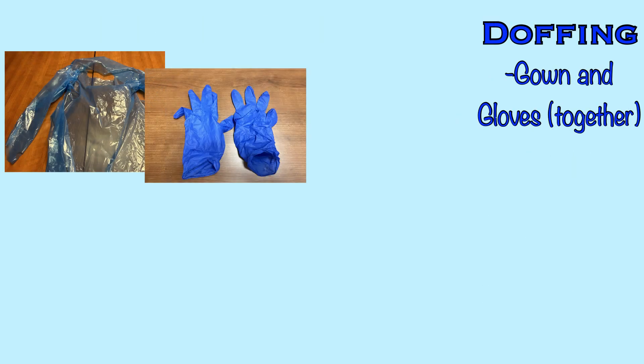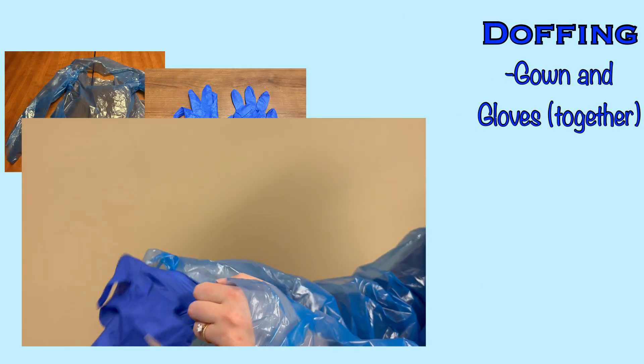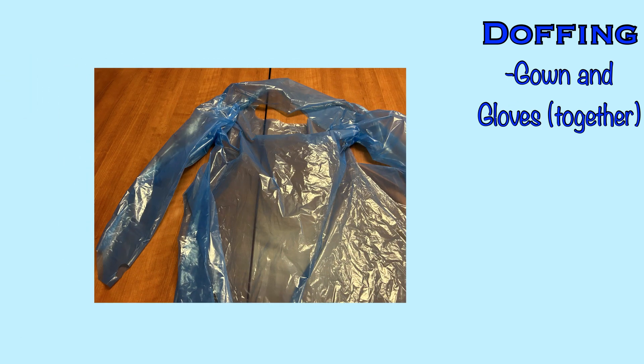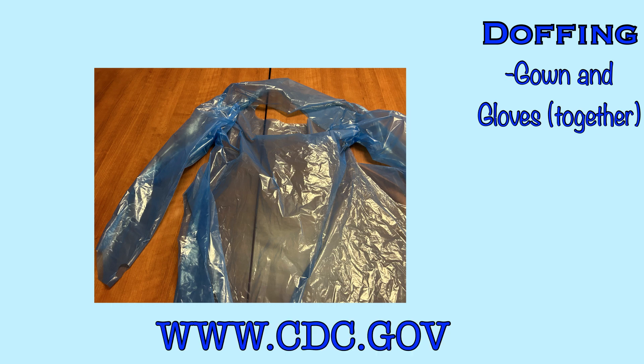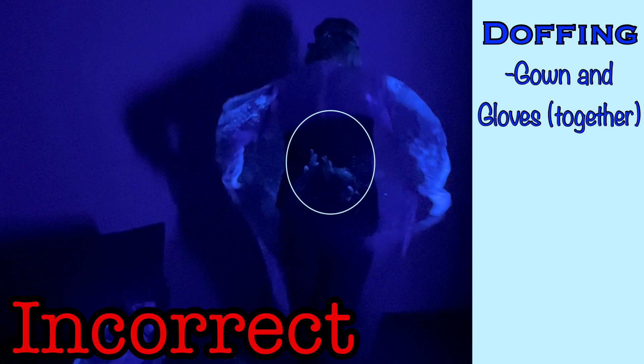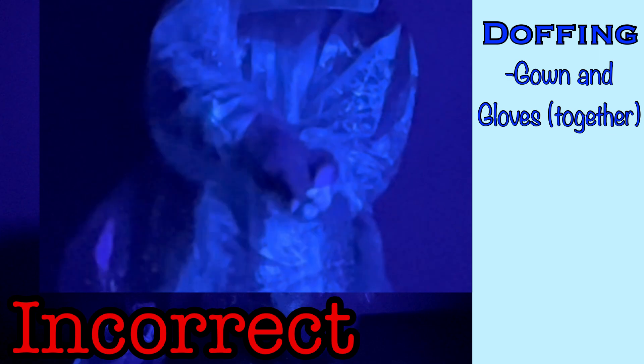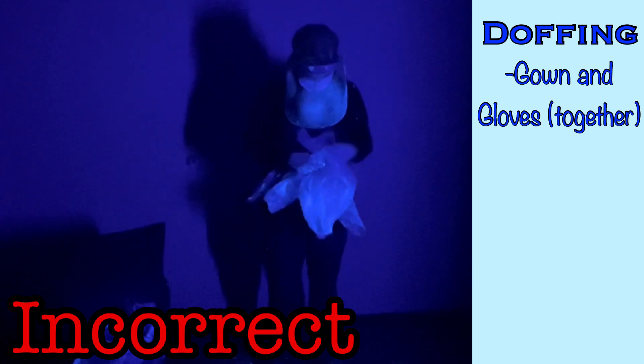First, you will remove the gown and gloves. Because you donned the gloves over the wrist of the gown, you will be able to remove both of these items in one motion. In this video, we are utilizing a tear-away disposable gown. If you have a non-tear-away or reusable gown, the process will be slightly different, and you can reference that process on the CDC website. In the incorrect example, we saw the nurse first untie the back of the gown, spreading the infectious agent to her back. Then she removed her gloves, also not using proper technique, and contaminated her hands. And then she continued to contaminate her hands further by pulling the gown off by grasping the outside contaminated surface with her bare hands and gathering it up before disposing of it.